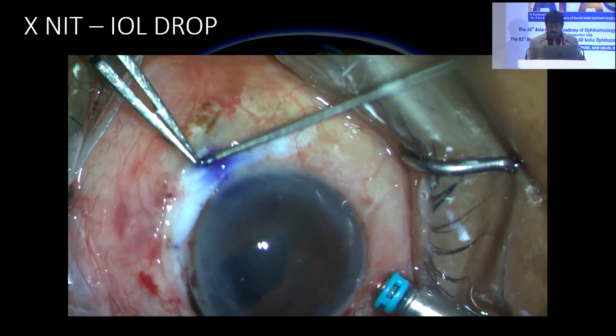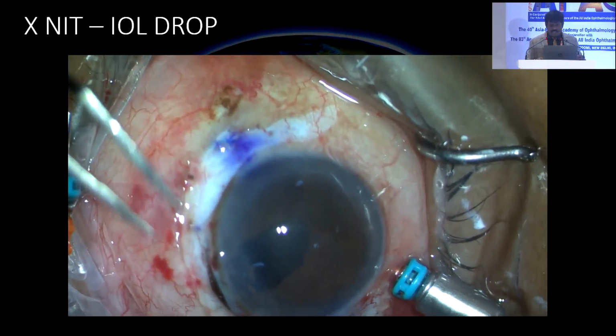Once the haptics are out, you just need to push it inside the pockets, and there it stands safely for life.